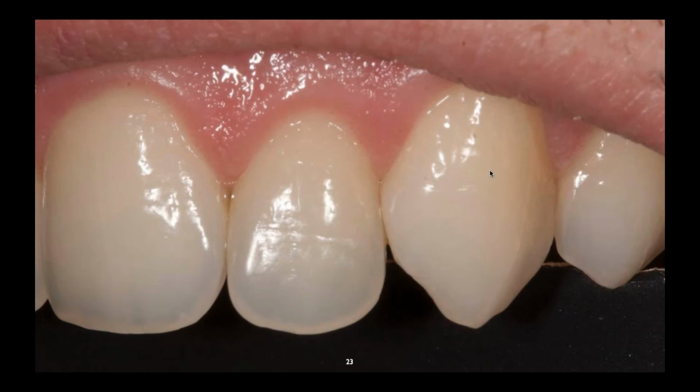And yellow is a bad word to use around patients, so you might want to say something like this. And these teeth are softer because they're thinner and more translucent. So I use the normal enamel on this, and then I could bring in a slightly lower value enamel, and I could use the same dentin or the same zirconia. If it comes out nice, the zirconia color takes care of all this area, and then the enamel should take care from here to here.